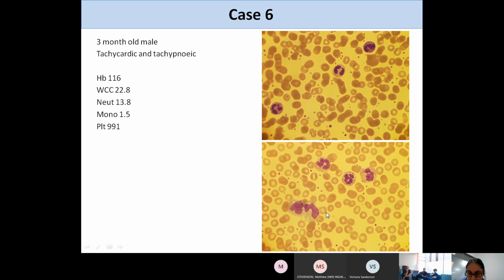We also have some monocytes here with little pale dots in the cytoplasm. This is vacuolation. And this is another reactive feature that you can see post-infection, little vacuoles of lipids in monocytes and neutrophils that are full of either lipid or cytokines or whatever, ready to be released to fight infection.